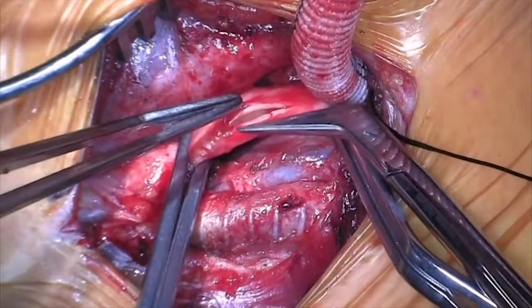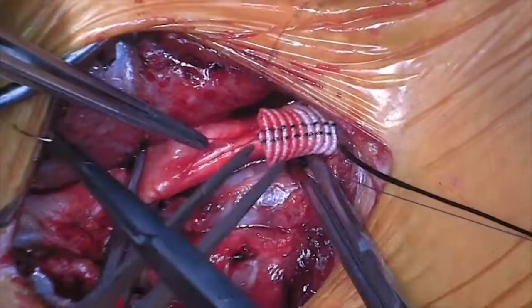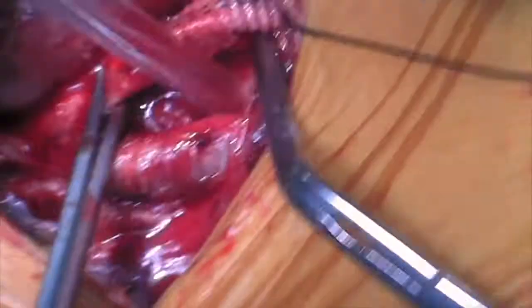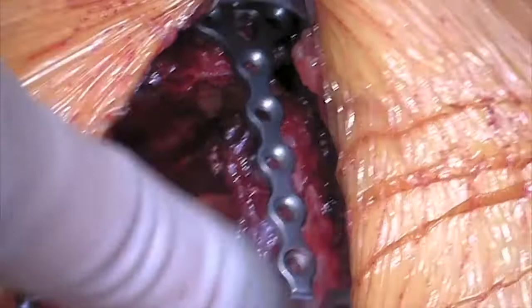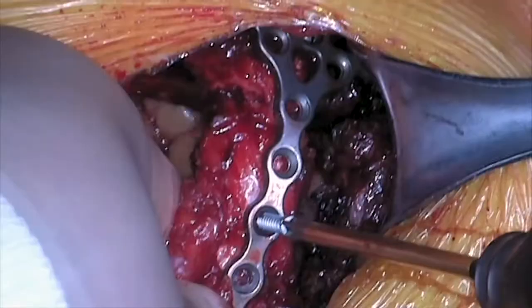Our distal anastomosis was then constructed using 5-0 Prolene suture in the standard fashion. Clamps were removed and our anastomosis was free of leaks. We have elected to empirically plate this patient, as the clinical experience in our institution demonstrates superior pain control. This concludes our video and we hope you enjoyed our demonstration of aortic carotid bypass.